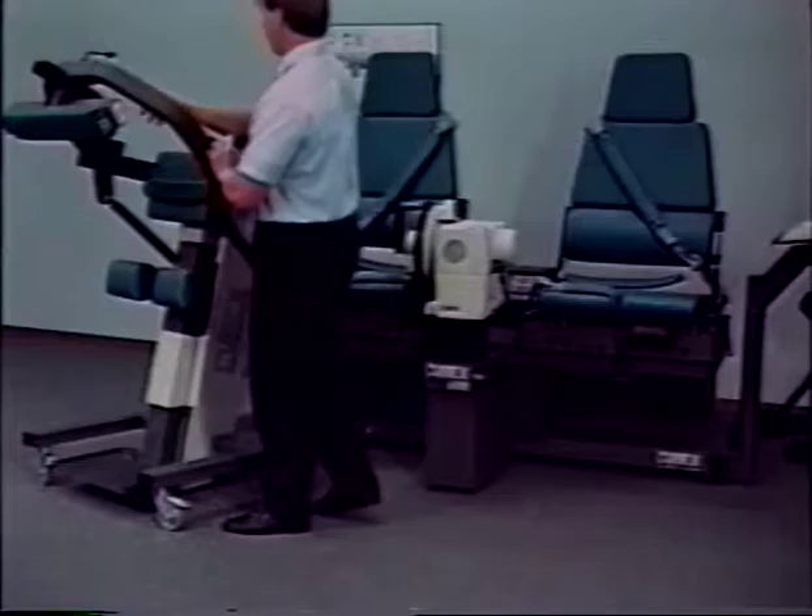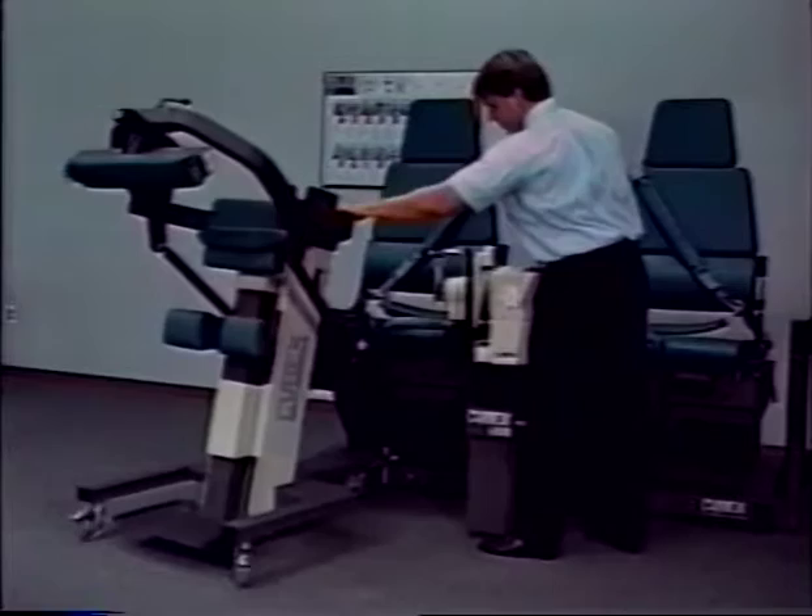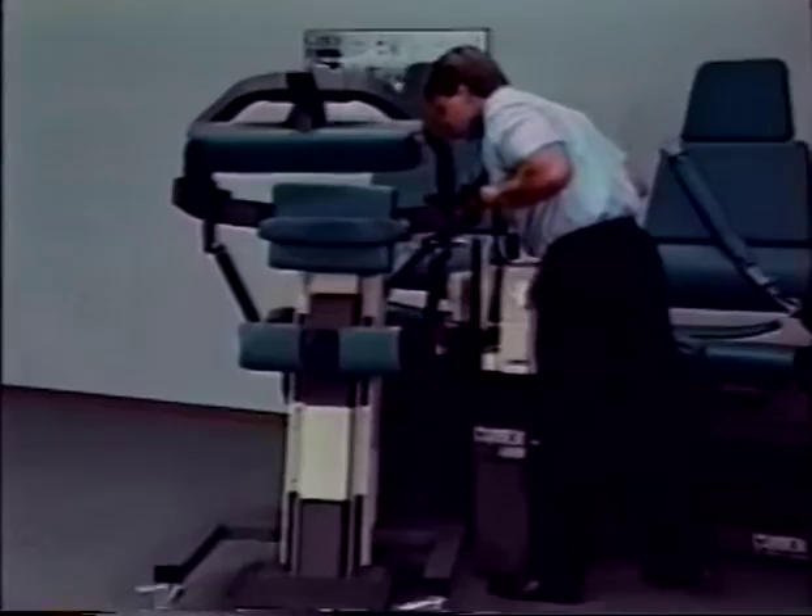Rotate the dynamometer and pull the TEF modular component towards each other. Position both so that the dynamometer input tube is directly above the docking adapter.